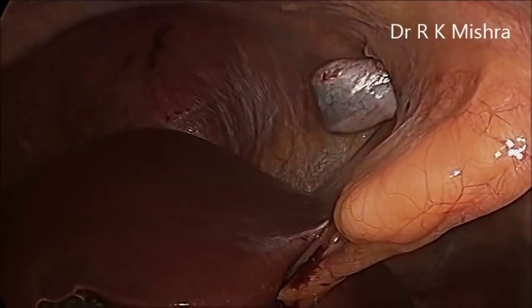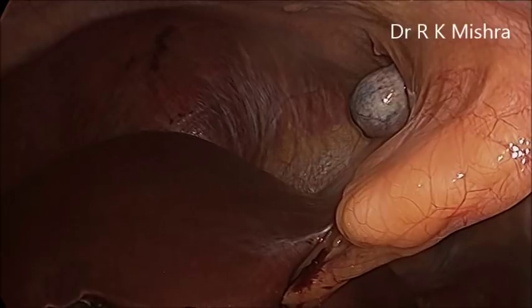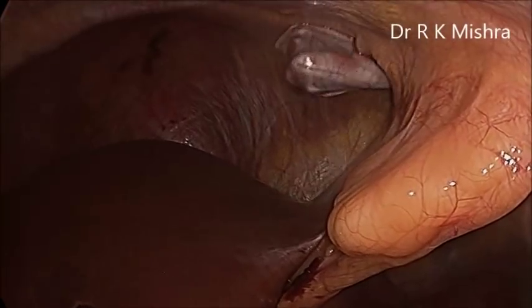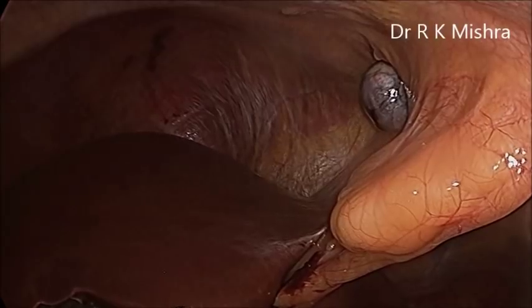Here you can see still many stones are there, and with the ovum forceps all the stones are crushed out, and slowly the gallbladder will be taken. Of course it is a time taking job, but it will do.